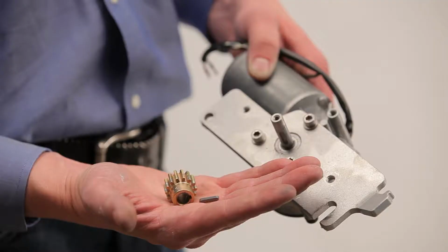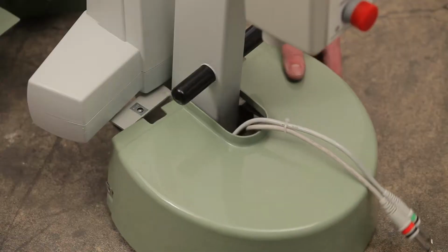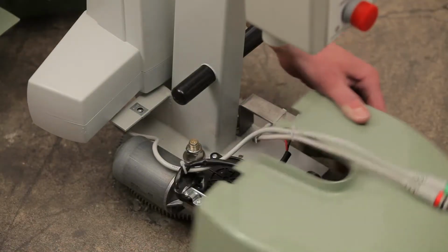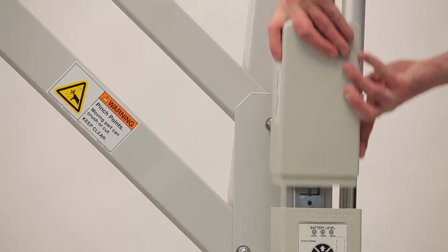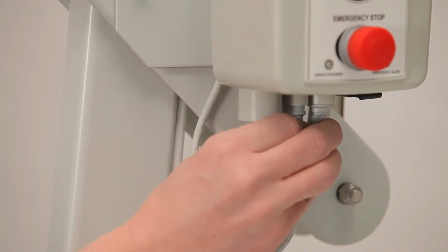If you need to replace the motor assembly, gears, or motor cable, you will need to disassemble the lift to gain access to these components. First, remove the battery, then unplug all cables from the control box, including the hand control.